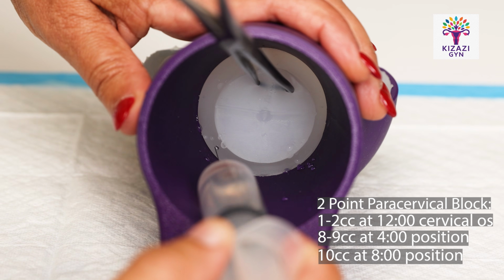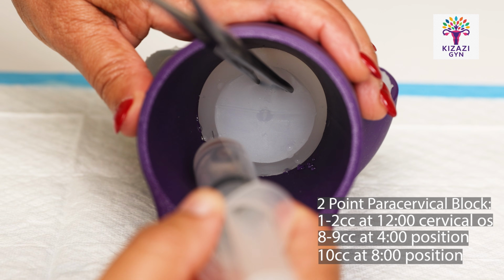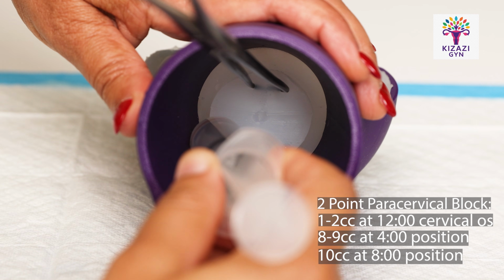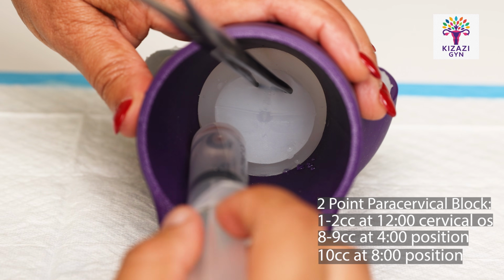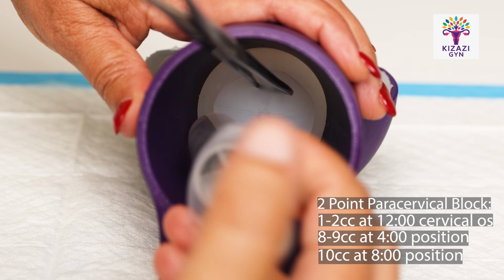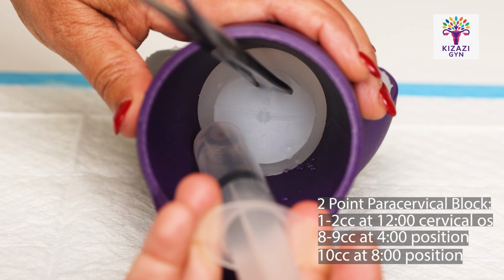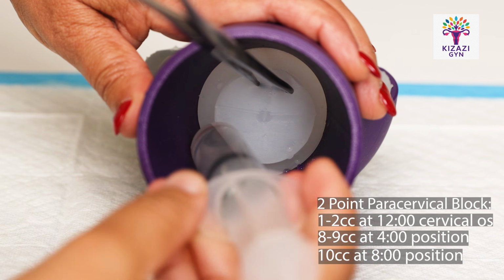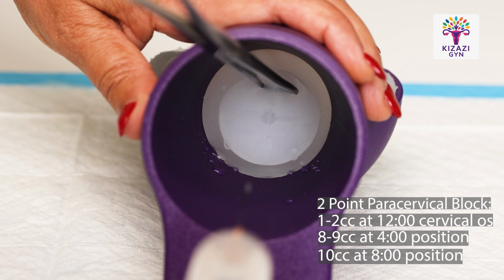You're then going to move to the 8 o'clock position, paracervically. You're going to insert again 1 to 3 centimeters. Once you get to where you want to be, you're going to aspirate again, and then you're going to go ahead and inject the rest of your lidocaine. And then you're going to go ahead and come on out.